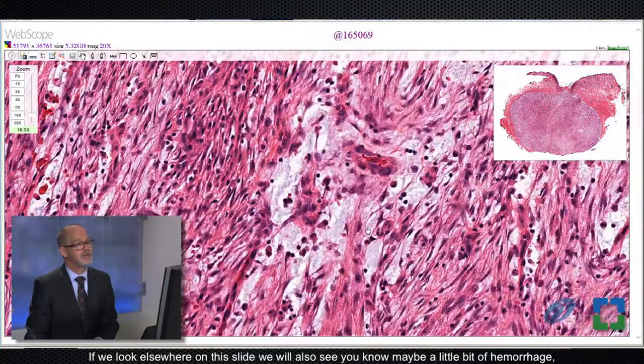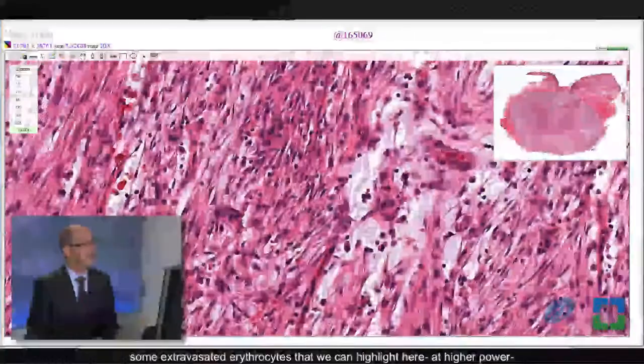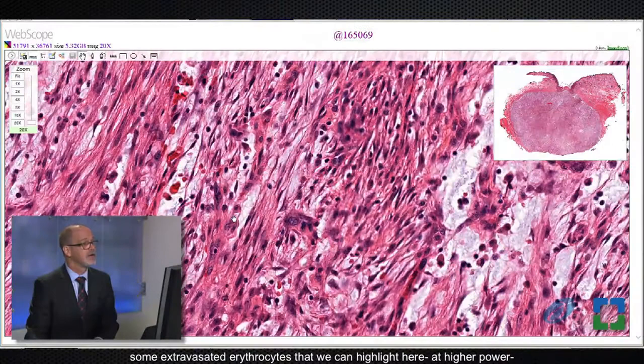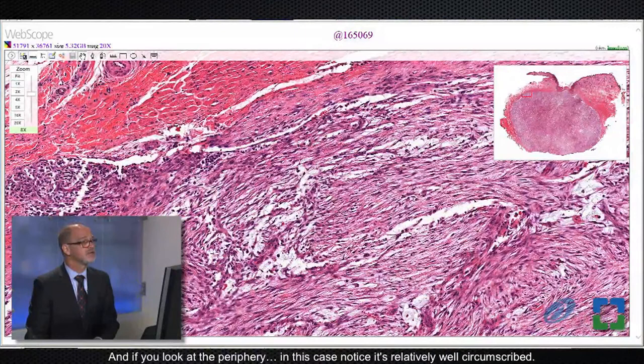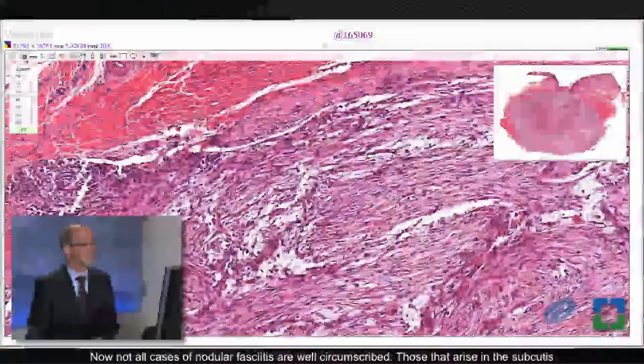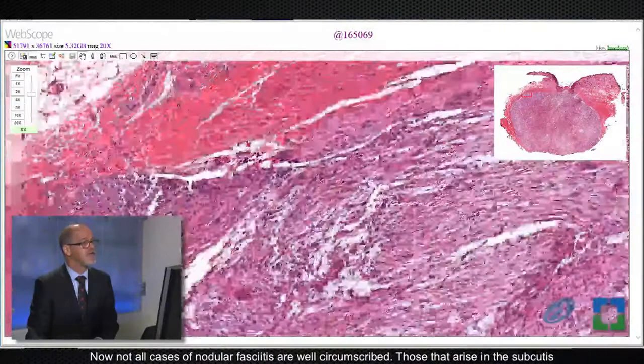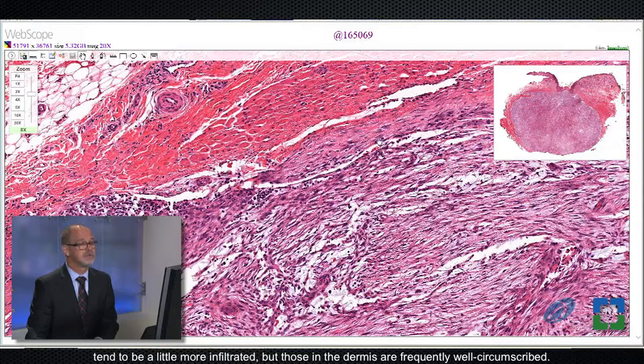If we look elsewhere on this slide, we will also see maybe a little bit of hemorrhage, some extravasated erythrocytes that we can highlight here at higher power. Those are both very common features that we see in nodular fasciitis. If you look at the periphery in this case, notice it's relatively well circumscribed. Not all cases of nodular fasciitis are well circumscribed — those that arise in the subcutis tend to be a little more infiltrative, but those in the dermis are frequently well circumscribed.